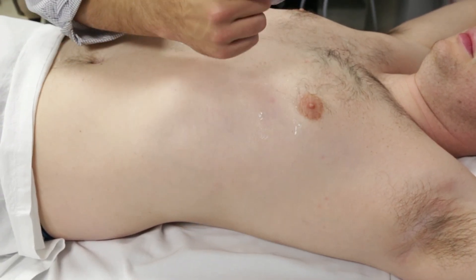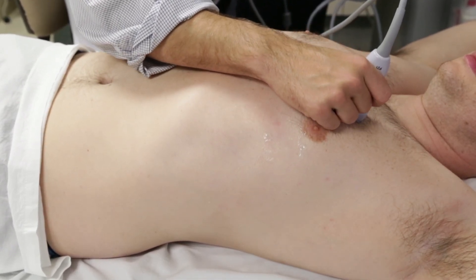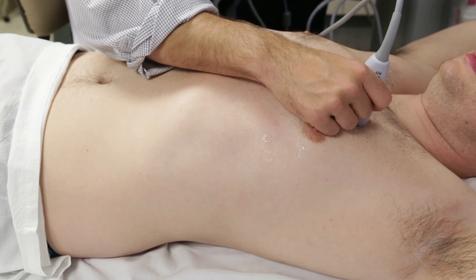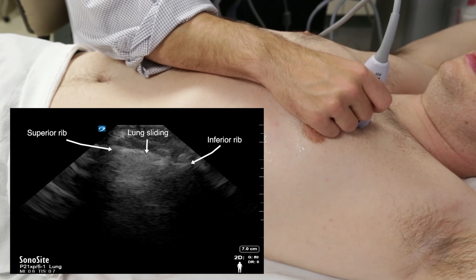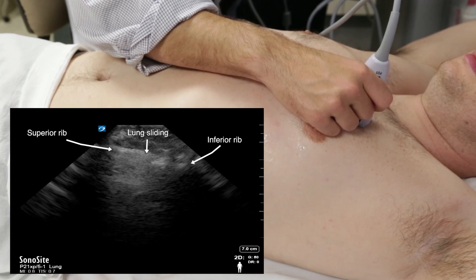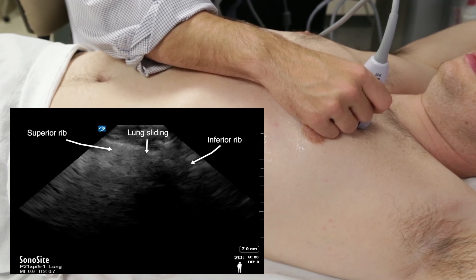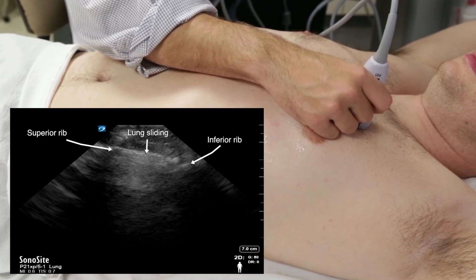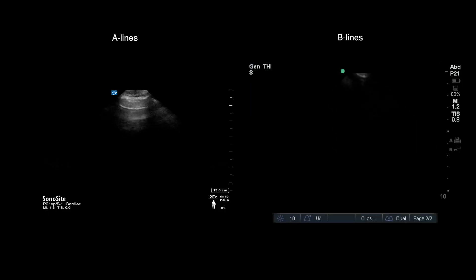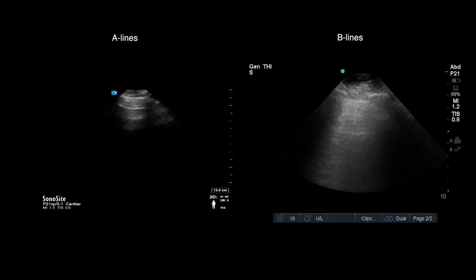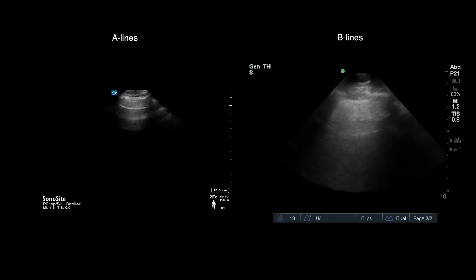We will start with the left hemithorax near the second or third intercostal space at the mid-clavicular line, with the probe marker oriented cephalad. Here you can see the superior and inferior rib; the space between is considered a window into the pleural lung parenchyma. In this view, you can identify the presence or absence of lung sliding as well as observe one or two common pleural artifacts called A-lines and B-lines. Noting the predominant pattern of these artifacts as you complete the rest of your scan can be a useful diagnostic tool.